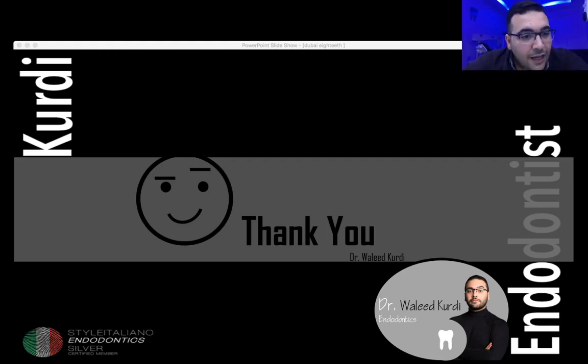Any other question? I think, yes. What is your thought on using a modified high suction tip to retrieve the file after the file is loose from the ultrasonic? I'm not against, indeed. If you can use it, it will be fine. I'm not against that at all, because I know that, by the way, we have some future attempt to remove the file. For example, they started to try the electromagnetic waves.